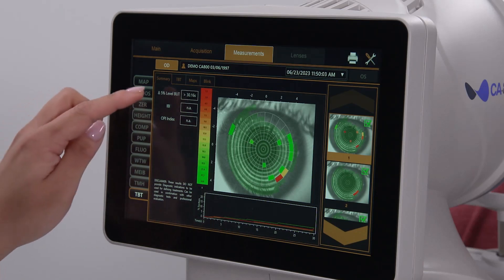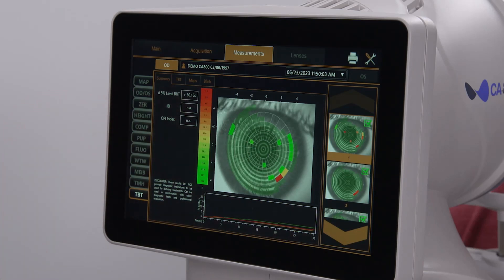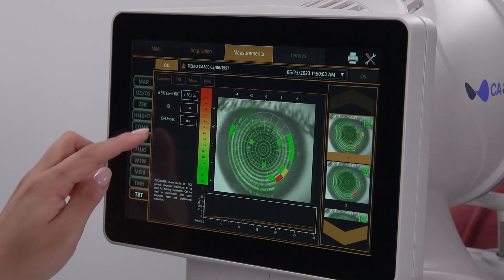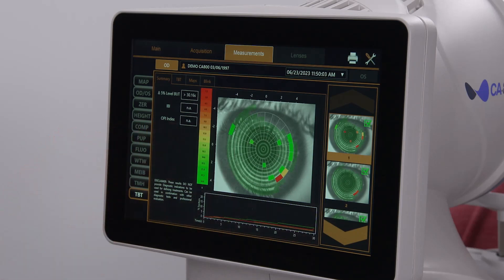The top figure is the time for 5% of all segments to break up. The inter-blink interval is the average time between blinks. And the ocular protection index is the ratio between the 5% breakup time and the inter-blink interval. For OPI values greater than 1, the patient blinks before the tears break up. For an OPI value of less than 1, the ocular surface is at risk because the tears break before the blink.